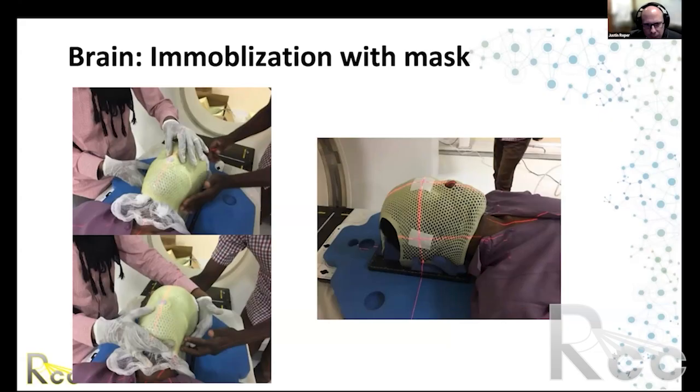In our practice, we will commonly roll back or flip out the lower part of the mask before making contact with the chin, just so that that area is a bit smoother where it makes contact with the skin of the neck, such that it's less likely to poke into the patient. Something similar can be done with other aspects of the mask that make contact with the skin.